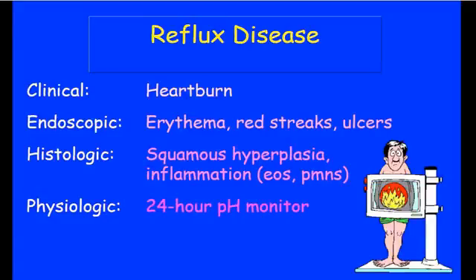Sometimes they're right, sometimes they're not. I think they have a hard time distinguishing ulcers from Barrett's mucosa. That's one of the reasons we get biopsies. But there is a grading scale that they use. Histologically, the things that we look at, which we'll look at in a second, really are just things of chronic irritation. There's nothing magic about what reflux does to the esophagus.